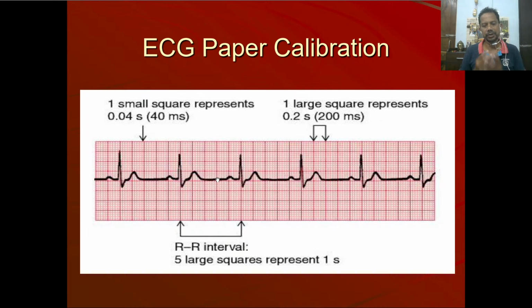If something is positive in aVR, if ST is elevated in aVR, it could be a very bad sign of right ventricular MI or inferior wall MI or some lateral wall MI or something like that. Some arrhythmia is happening or some junctional beat is firing upright.